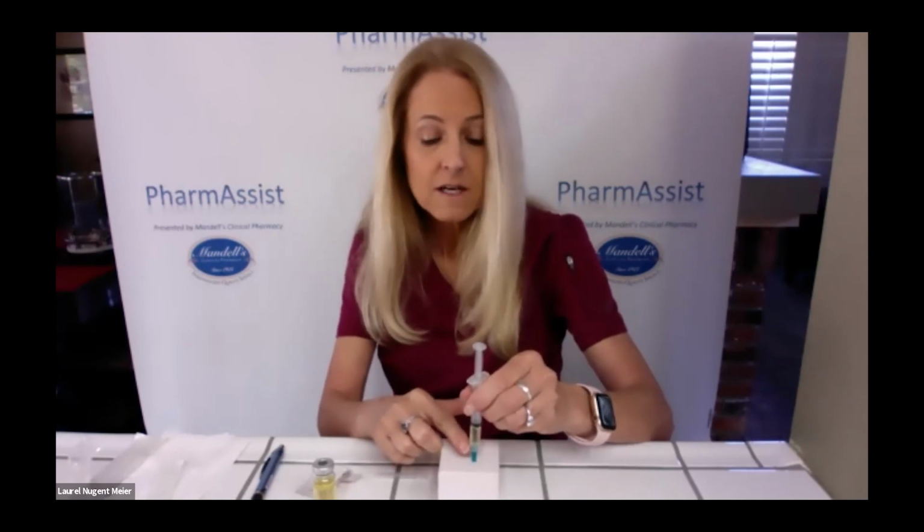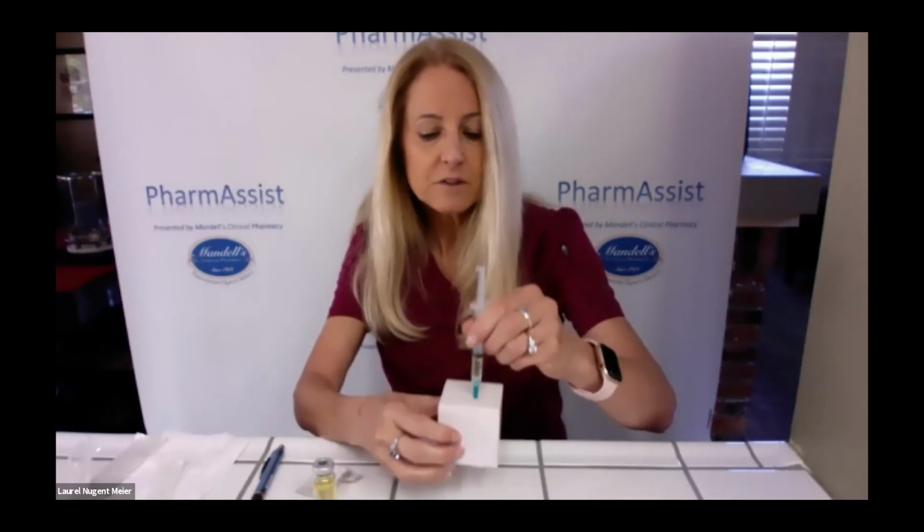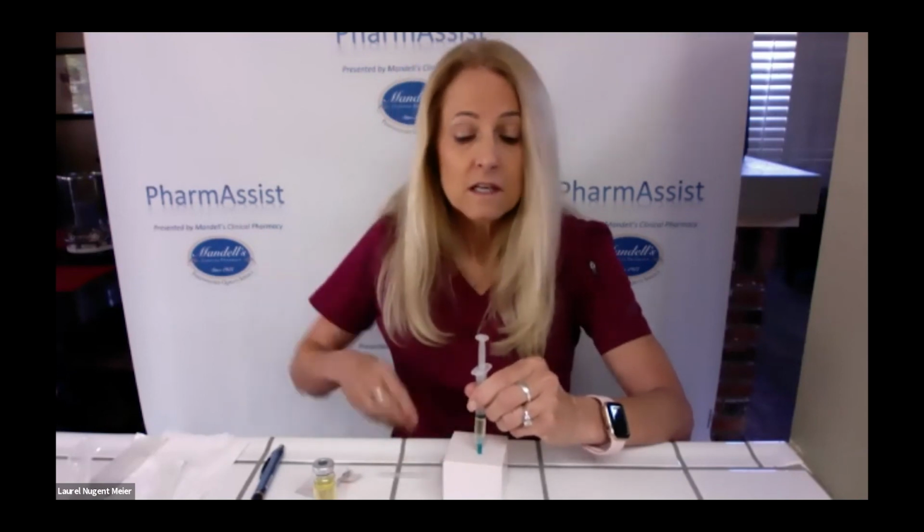It's very rare, but if the blood does come into the syringe, it means that the tip of the needle, which would be way down here in the muscle, is lodged directly in a blood vessel. And we don't want to give the medication into a blood vessel. So what you would need to do at that point is pull out, change to a new needle, and give the shot in a different site. If you use the side of your hip or the ventrogluteal site, you can skip that step completely, okay?